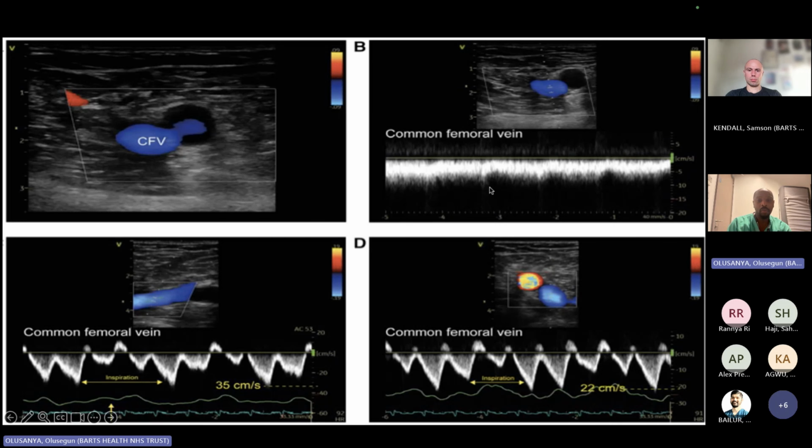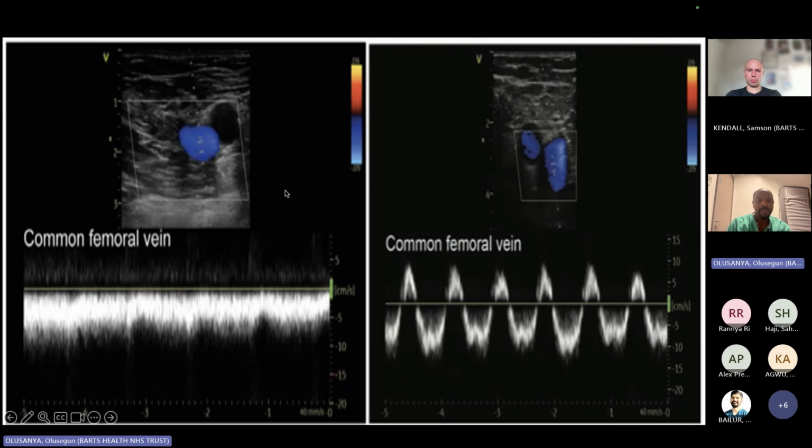What you can actually see is that normal common femoral venous flow is either continuous or has normal respiratory phasic variation. And then when people have signs of severe venous congestion, they actually get the sinusoidal waveform very similar to what you see in the hepatic vein. And I'm sure some of you have seen this, where you've put the probe on and both the artery and the vein have been pulsatile. You're not really sure whether you've stuck it in an artery or a vein, and you can get enough pulsatility that you actually get pulsatile flow coming back at you from your needle, and it can be quite scary. But often these are people who've got severe tricuspid regurgitation from some disaster to their right heart, and that's what you're seeing. So understanding VExUS allows you to understand that component, and sometimes this can be your first instinct to go and do an echo and look at their right heart.